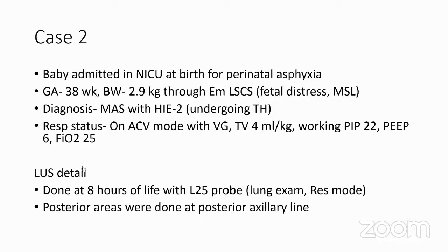The baby was intubated on assist control mode of ventilation with volume guarantee. The tidal volume was set at 4 ml per kg and the working PIP was quite high at 22. The PEEP was 6 centimeters and the FiO2 was 25%. I performed the lung ultrasound at 8 hours of life with the linear probe. One of the limitations was that I could not image the posterior areas ideally, and they were done at the posterior axillary line.